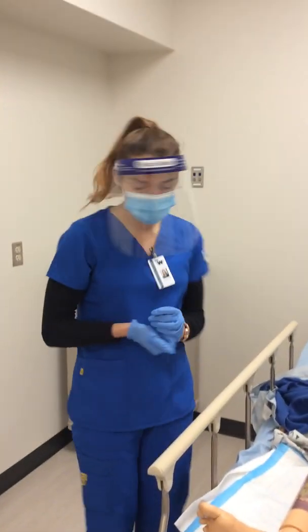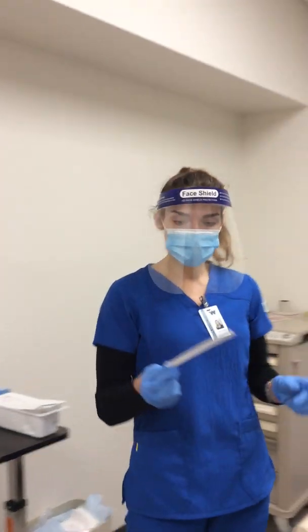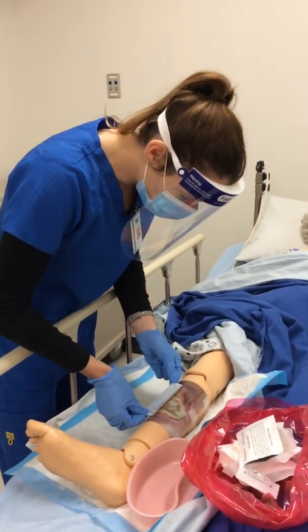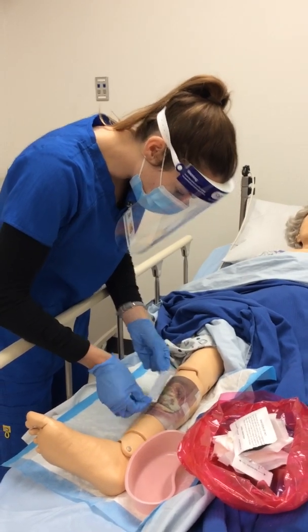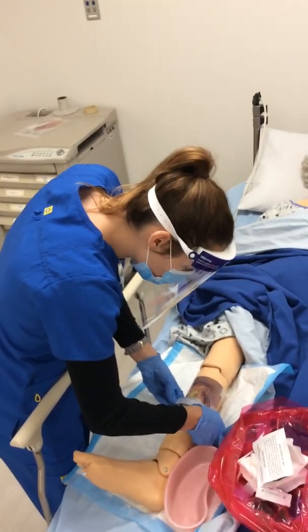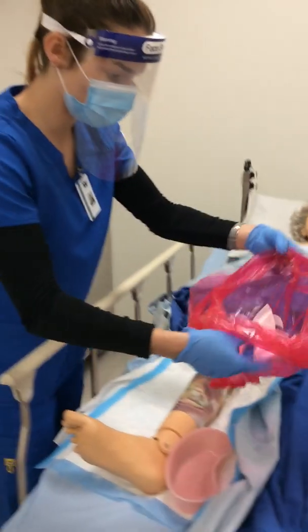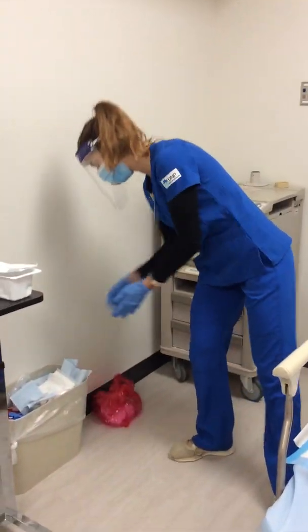I'm just going to measure the wound before I start the new bandage. And this is a paper measurer, so we can discard it when we're done. It's a one-time use. So we've got 15 centimeters by 13 centimeters. Okay, Shirley. So we're going to get rid of the dirty, place that in the bigger bottle, remove my gloves, wash my hands.